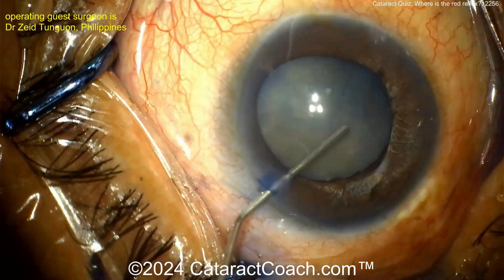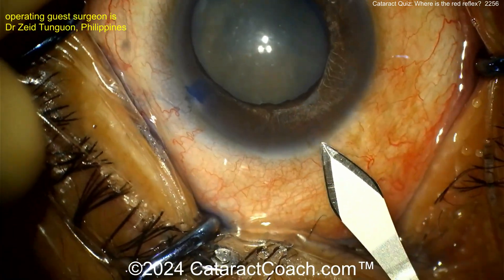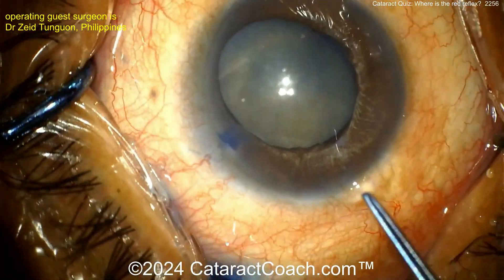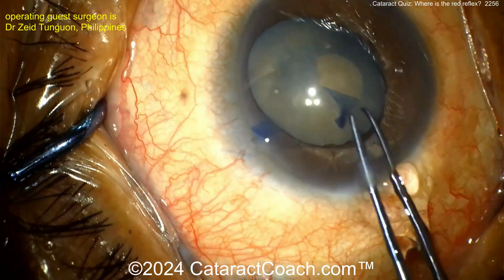Is there a gap in zonular support that's allowing trypan blue dye to go into the vitreous cavity? I think that's our issue. Let's see the main incision being made here, and now let's start the rhexis. The capsule looks pretty reasonable — a good-looking rhexis here.